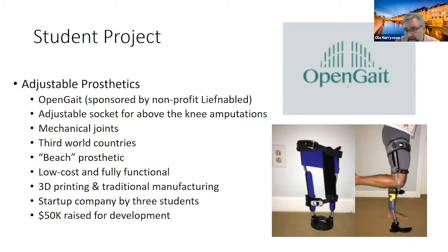And of course, a traditional prosthetic with a computerized knee, maybe a computerized ankle joint, is running anywhere in the $70,000, $80,000 range. So obviously, you don't want to take one of those to the beach. So the other idea is to have a stable, fully mechanical prosthetic that they can use with activities where their regular prosthetic is not going to fit.